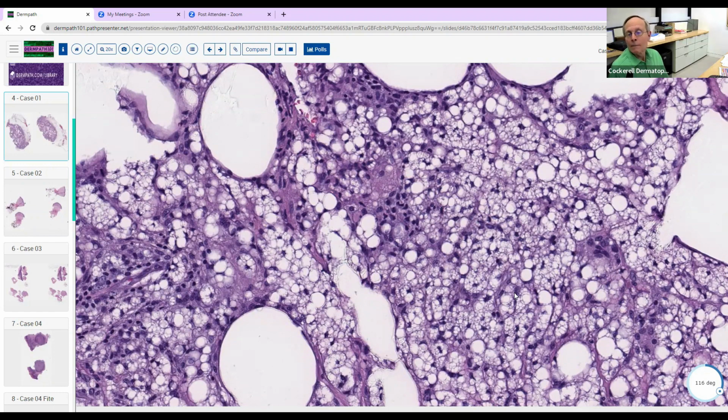If somebody gets an automobile accident, they get glass in their skin, these crystalline foreign materials that polarize. Silicone usually doesn't polarize. You've seen silicone, like silicone breast implants. It's a clear, oily looking material. And people do, sadly enough, inject this into their skin for various reasons.